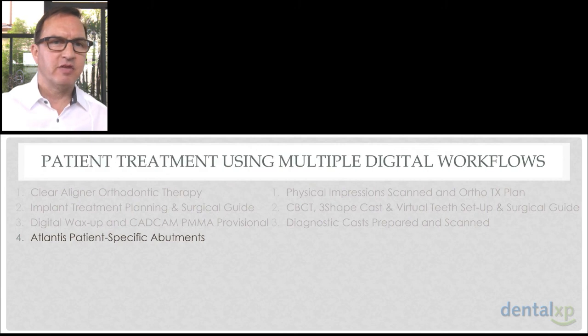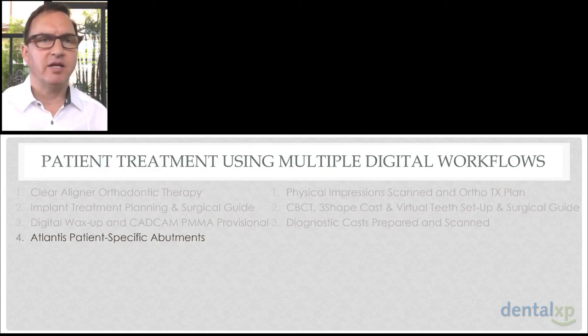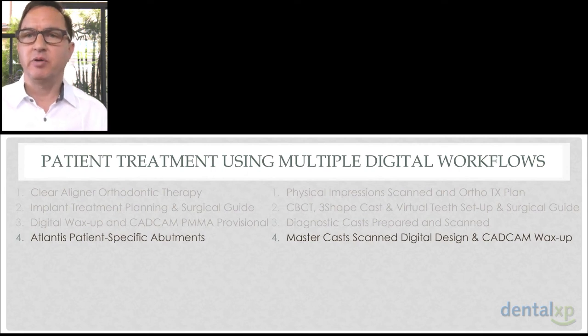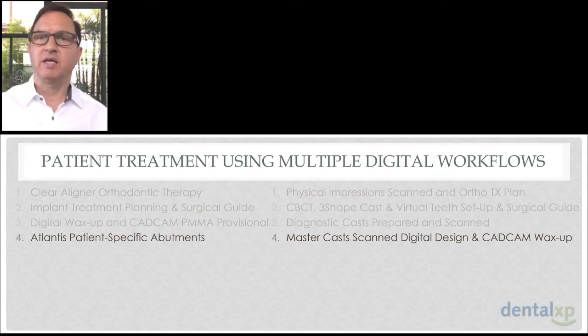Once the patient is provisionalized and final impressions are made, we like to use Atlantis patient-specific CAD/CAM abutments. Well, the way we accomplish that is from the master cast, we scan and perform the digital design. If we have multiple implants, Atlantis will request that we submit a wax-up that seats onto the master cast. So we made the physical impressions, scanned that, performed the digital design, and exported an STL file for the creation of a CAD/CAM wax-up, which seated onto the master cast.